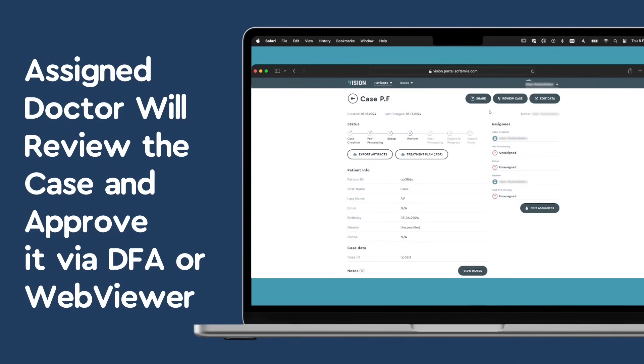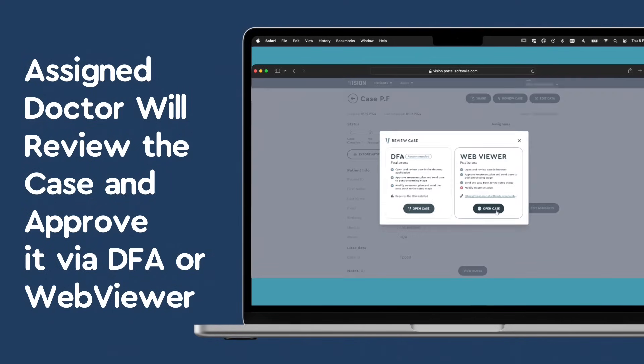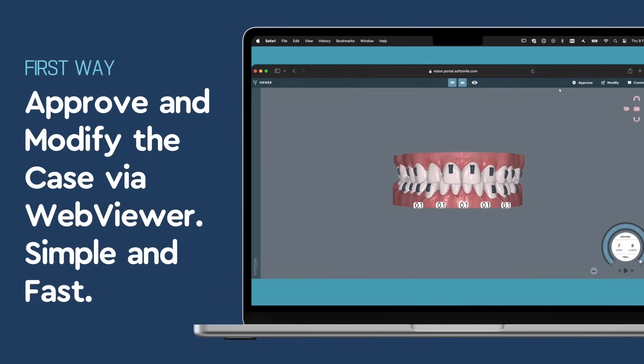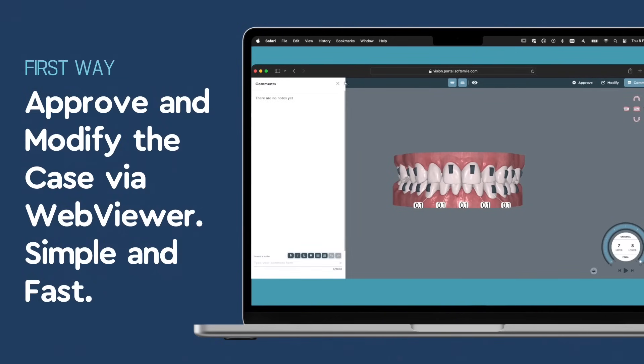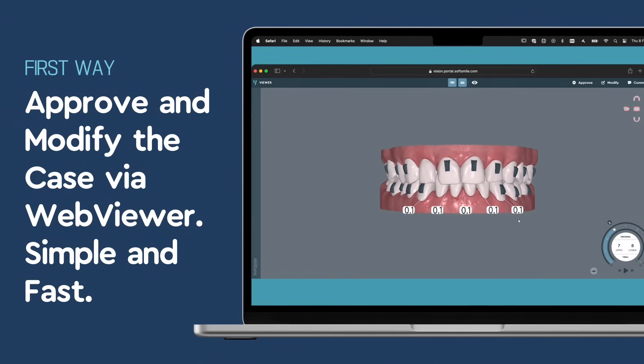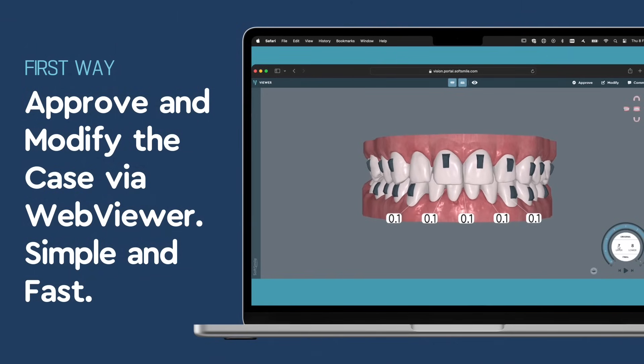Click on the provided link to open the WebViewer and examine the setup. If you have any observations or require adjustments, use the comment feature within the WebViewer.